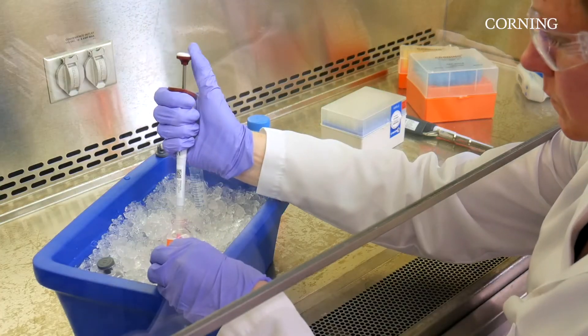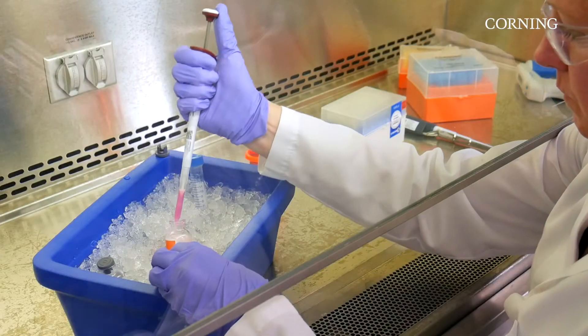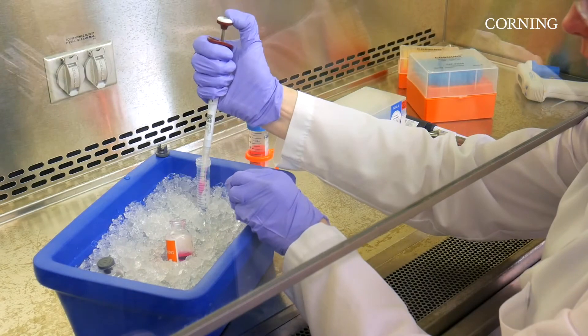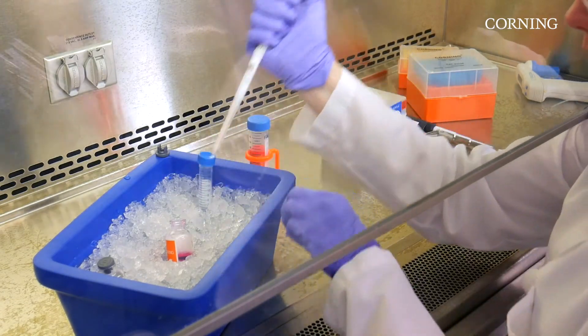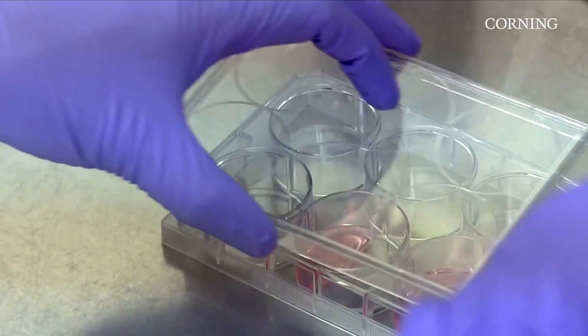In the 30 years since the launch of Matrigel Matrix, some recommended methods have developed. These are best practices that anyone can use while working with Matrigel Matrix regardless of application. This video covers how to coat with Matrigel Matrix using the thick coating method.